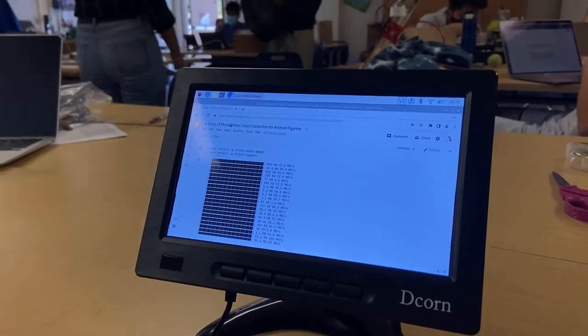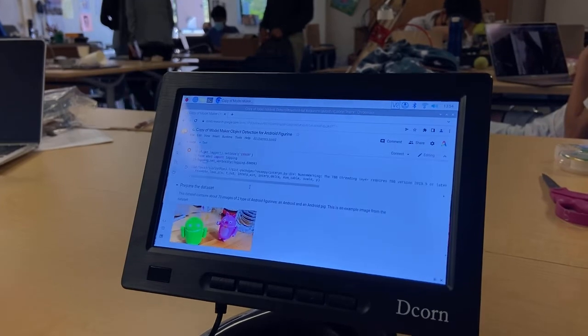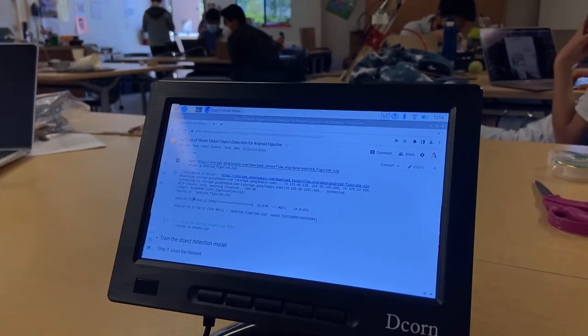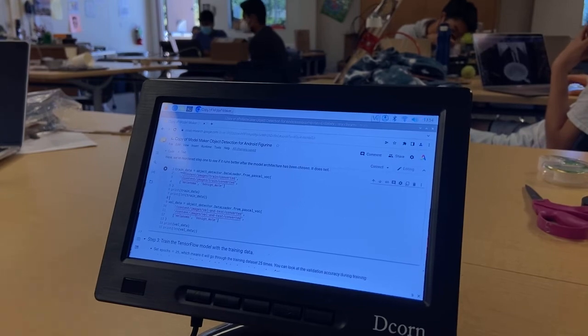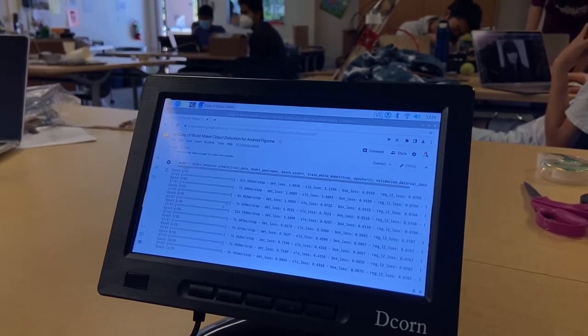Here's the package installation and the imports. And here is the unzipping of the Android and melanoma and mole files. Here we define train data and val data. And this is how the model is actually training.